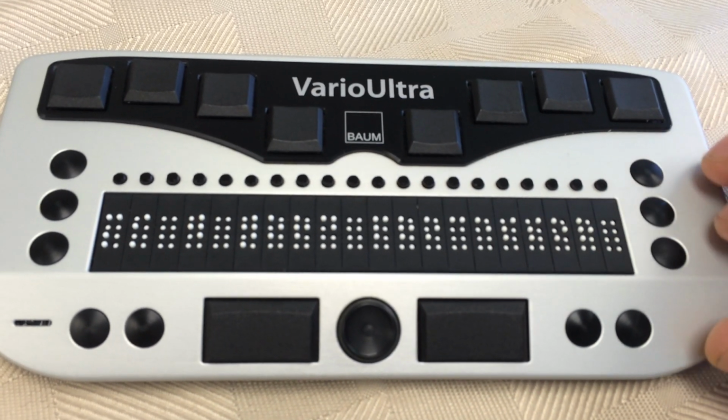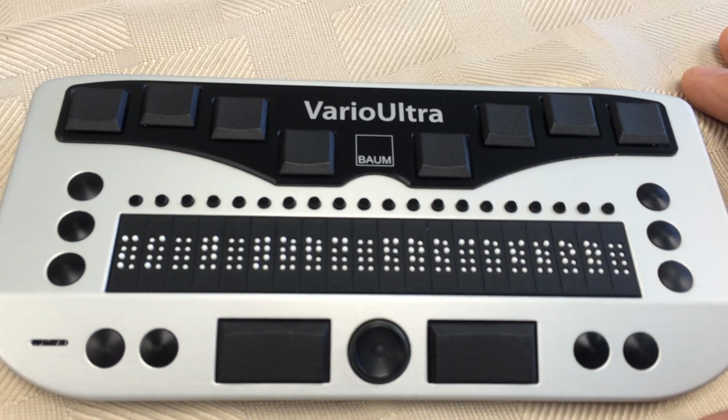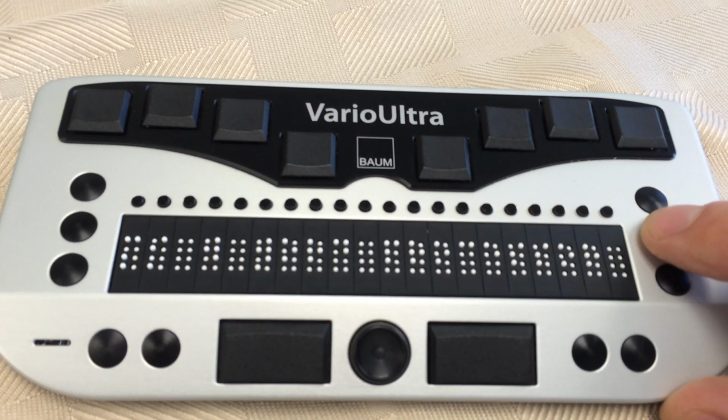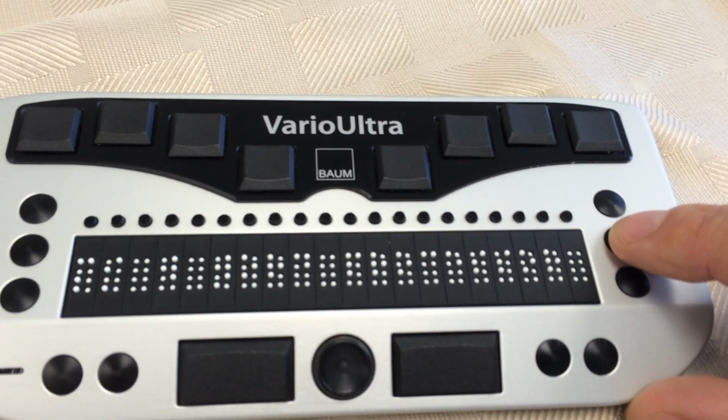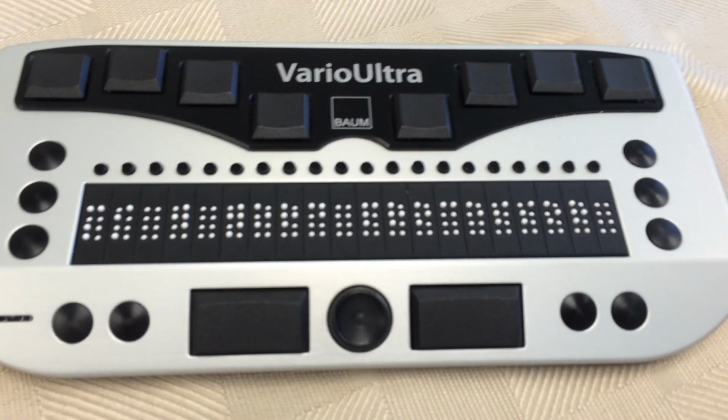We can use these buttons for a number of different commands, including navigation. If you're reading along a line and you need to see if there's anything more, you can simply press the D5 button over on the right-hand side, and the display will refresh itself and show you new information.